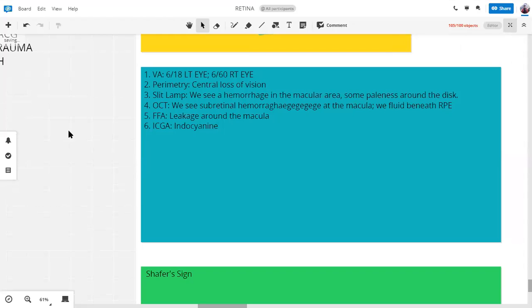Because FFA, fluorescein angiography, does not stay as long inside the choroid as it stays inside the retina. That is, fluorescein stays equal amounts of time or less time in the choriocapillaris compared to the retina. So it is used to better visualize the retina.